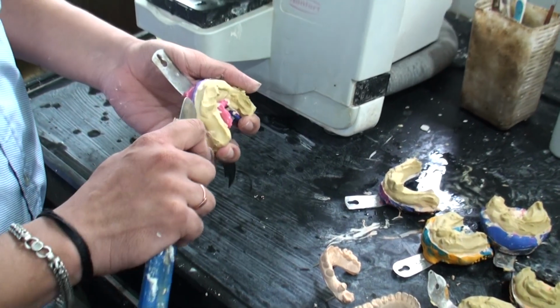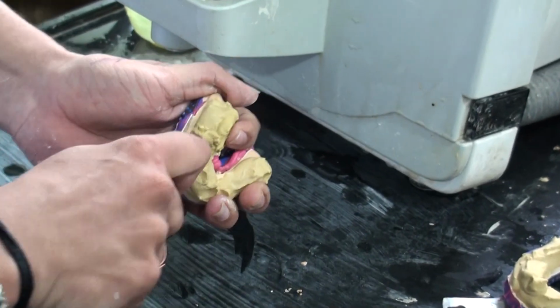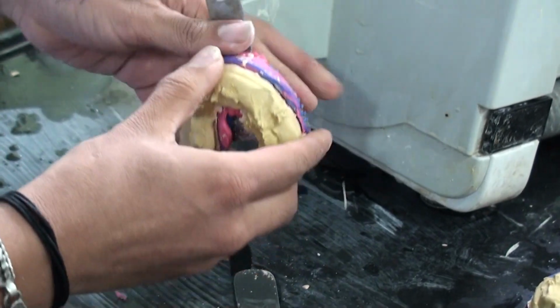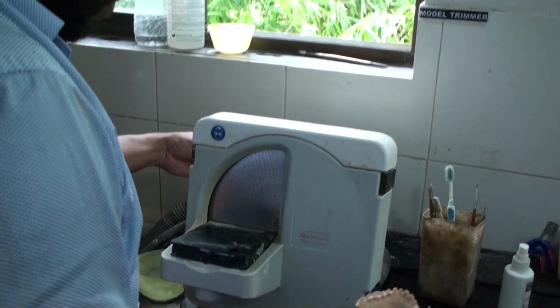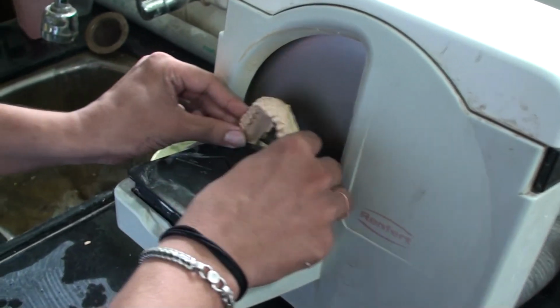That's the model board. Once it's set, he starts to slowly take it apart from the impression, doing it very gently, and there we go. That's the impression taken out. A good model. It doesn't have any air bubbles, and now it looks all rough on the edges, so we're gonna try and make it smooth.